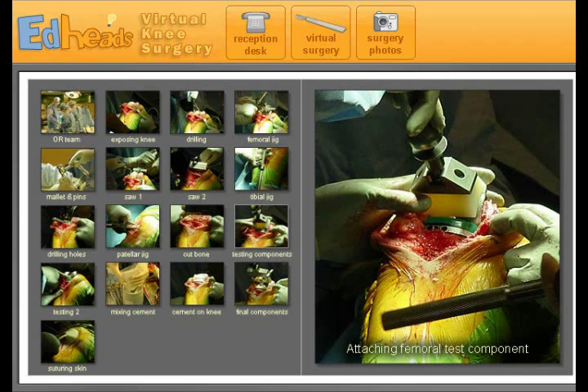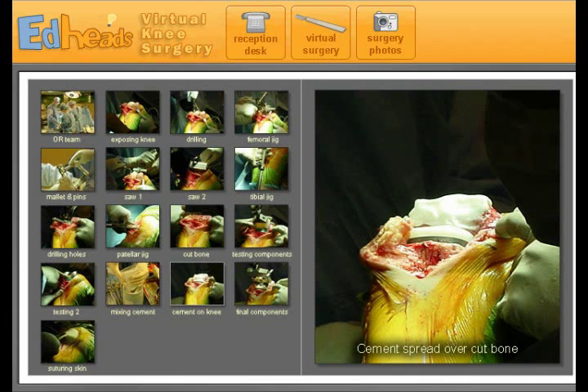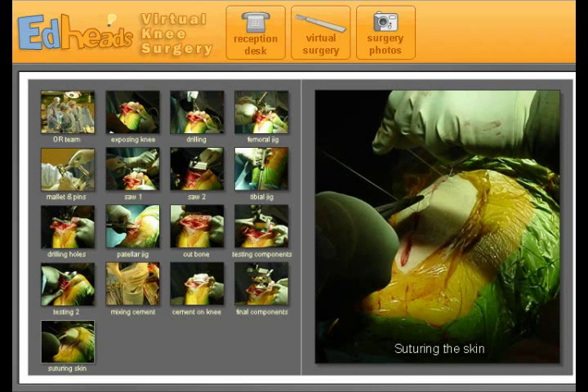Attaching the femoral test component — they're attaching the test plastic and metal stuff. Testing the tension. Mixing the cement. There's the cement spread over cut bone — it's green in the video probably so you can actually see it better. Attaching the final knee components. And suturing the skin. That was disgusting. Yep, and that is virtual knee surgery and photos of a real knee surgery.